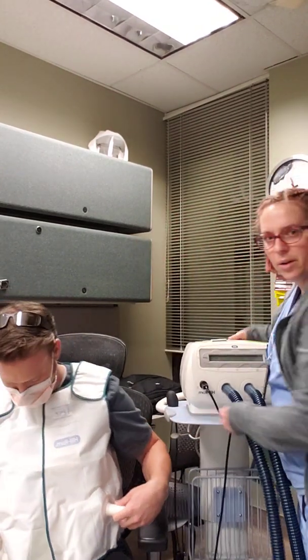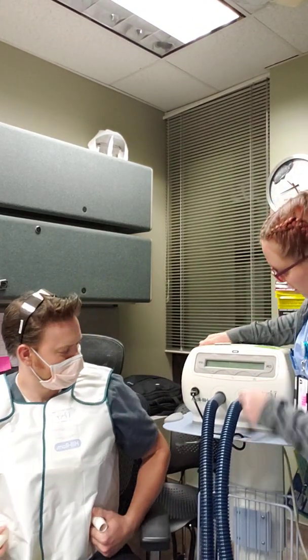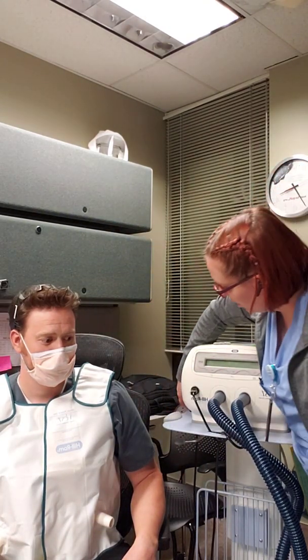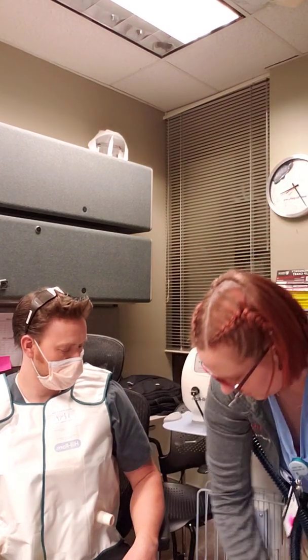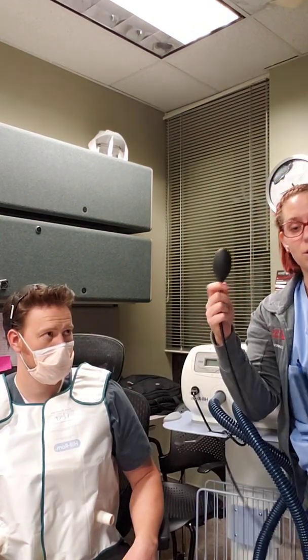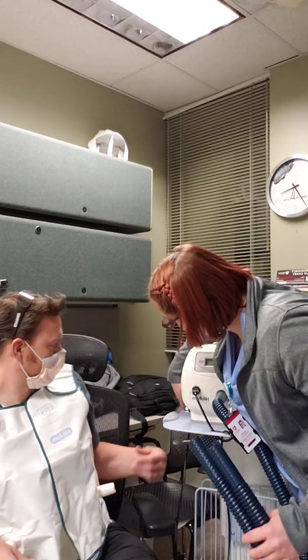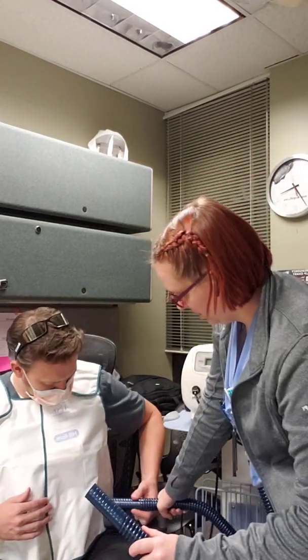We have these ports right here. They're a little hard to see. This is the machine used for high frequency chest wall oscillation. It's run by electricity, so you plug it in. We have our two tubes that attach to the machine here and here. We have a balloon where patients can start and stop the treatment as they need it. And then these tubes attach to the opening on the vest. They fit right in.